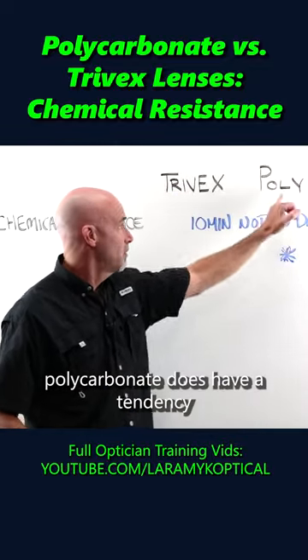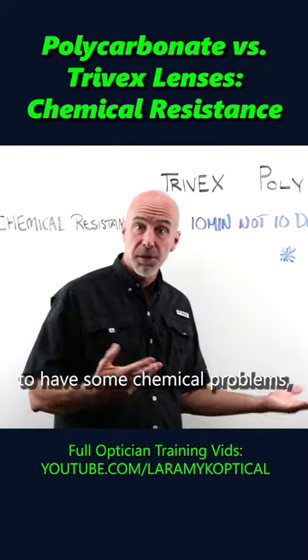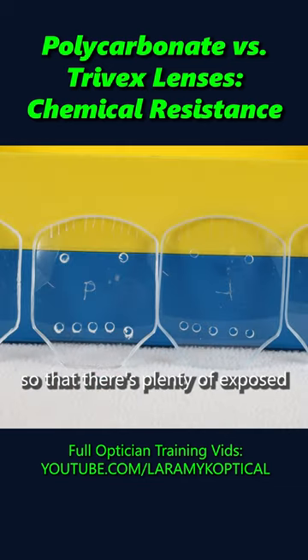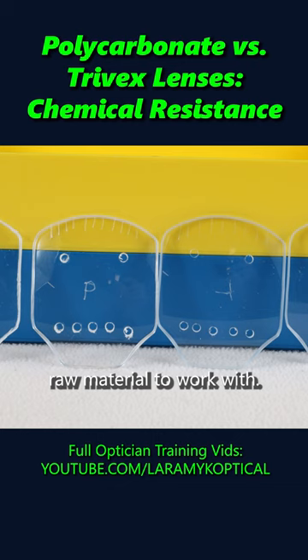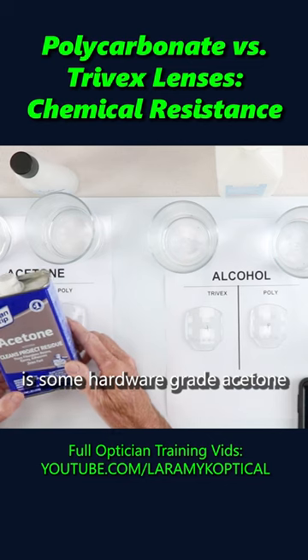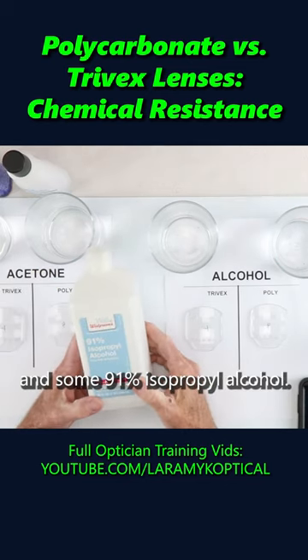Industry belief is that polycarbonate does have a tendency to have some chemical problems, particularly with acetone. What I did was edge these lenses so that there's plenty of exposed raw material to work with. I used some hardware grade acetone and some 91% isopropyl alcohol.